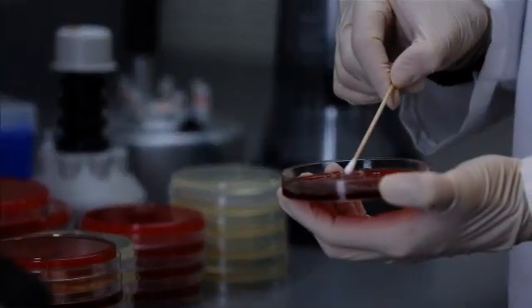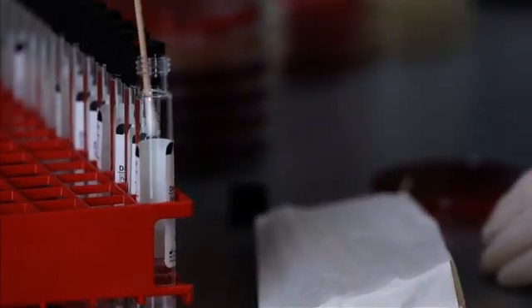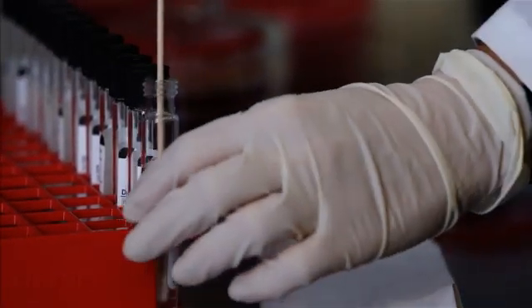Prepare the 0.5 McFarland turbidity broth by emulsifying several colonies from a pure culture plate. Use the suspension within 15 minutes.